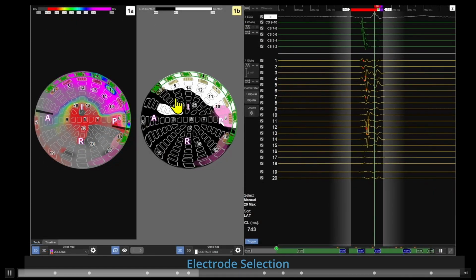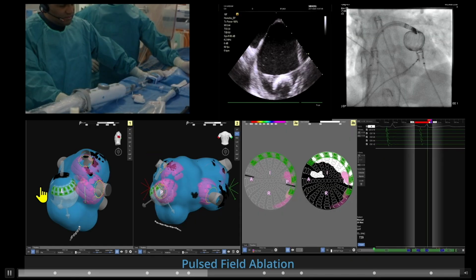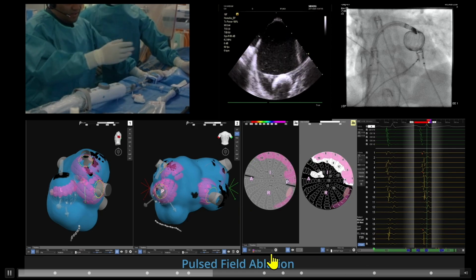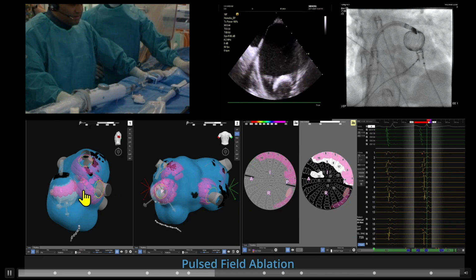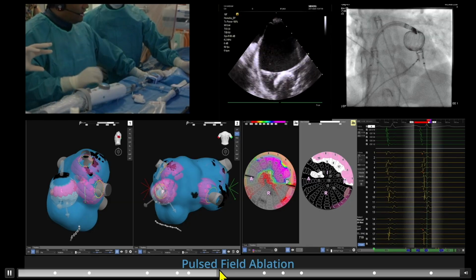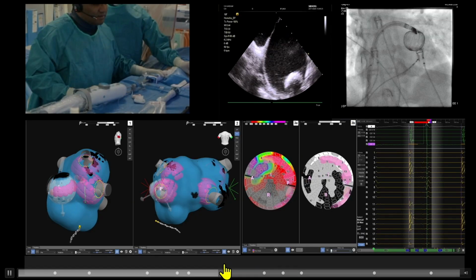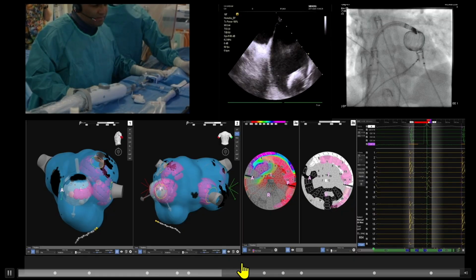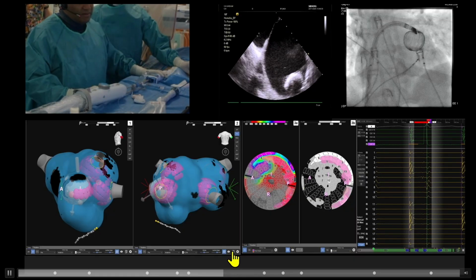And then we can select the electrodes that we want to deliver from these electrodes here. Again, this is easier to see when you see it on the map. So you can see right here, these electrodes you want to touch. So you select it, it's in good contact, and then we start delivering energy, and we're going to start ablating here. And at the end, you can do a voltage map really quickly, though obviously acute voltage changes after PFA is of questionable significance.